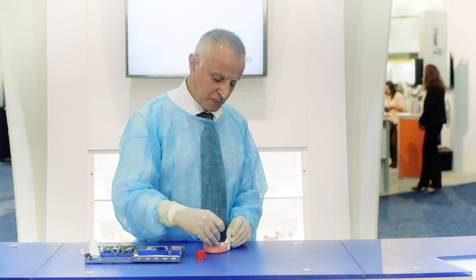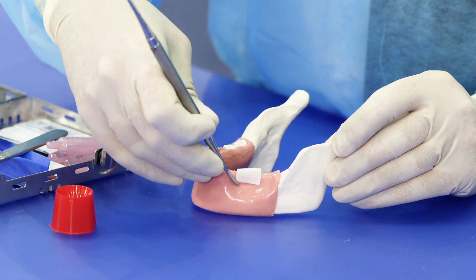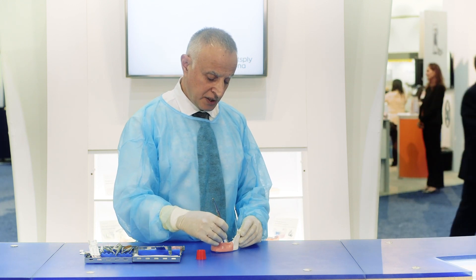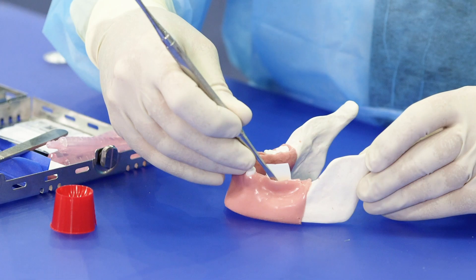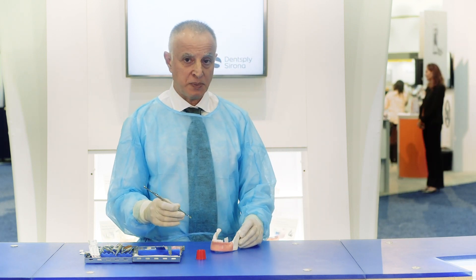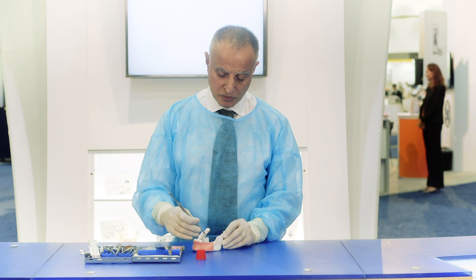Once the O6 Plus is secured under the lingual flap, we hold the buccal aspect and place the bone graft underneath the membrane on the buccal side to get the size and shape of the ridge that we are trying to build. Then we place the O6 Plus on the buccal side on the bone graft.